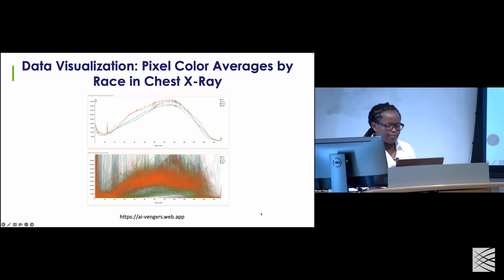We did look at this experiment showing the pixel amounts. And this is important. This was just good for us. By the time you get a chest X-ray, you start off with raw signal. That's not usually available to many people, actually even to us, because this is very.